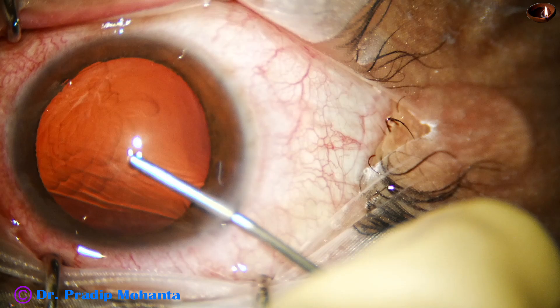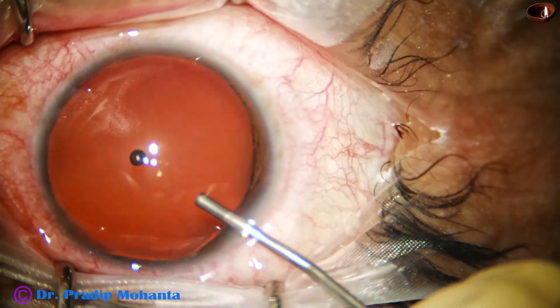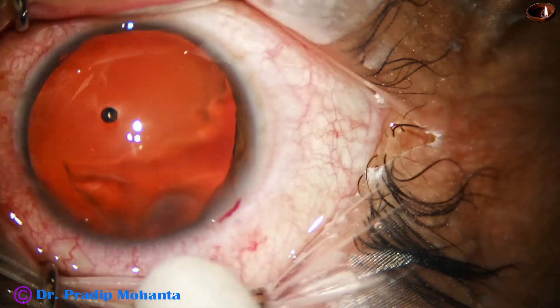The main incision has been made and as I inject viscoat, see the pupil dilates so much. We can hardly see the iris.